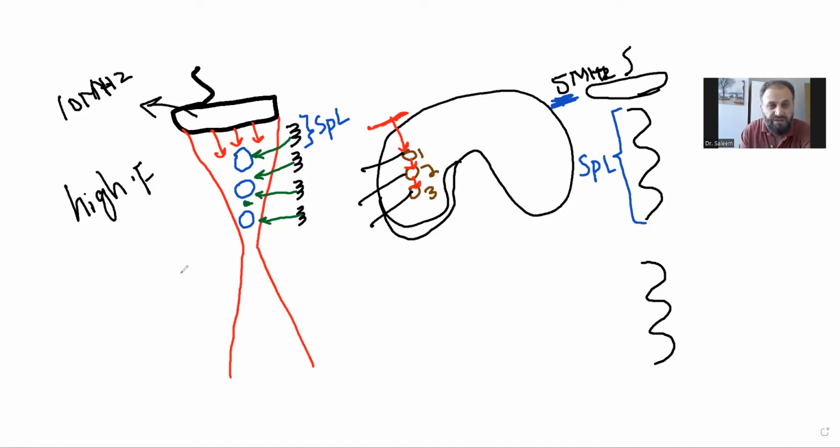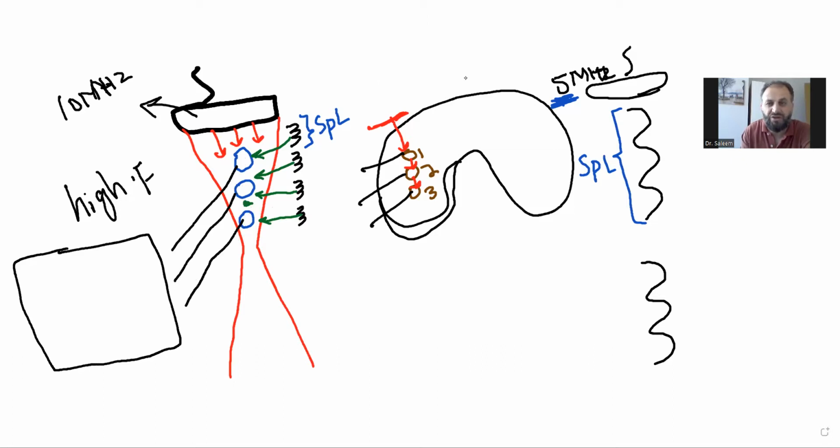Now, on the screen, when I'm looking at the display on my TV or any screen I'm using to see my images, pretend this is my screen, all these will be presented on the picture here for me. They will look exactly as they match the anatomy, whatever you see in the patient, if it's a human or animal. But the main thing is now you can do your correct measurements if you want to do side to side and anterior to posterior, or you can know the numbers of them, how many there are. So this shorter SPL will give you an exact, accurate copy of the information of what you see in this thyroid tissue. That will give you the detailed information about these masses, what they are, and plus they will tell you how many they are.